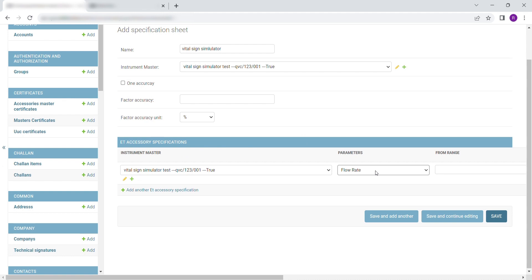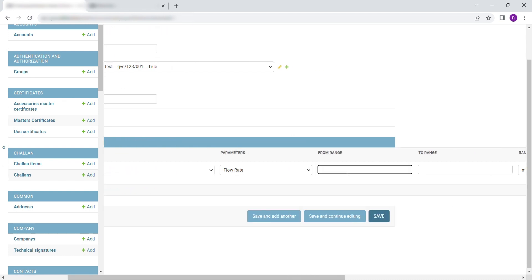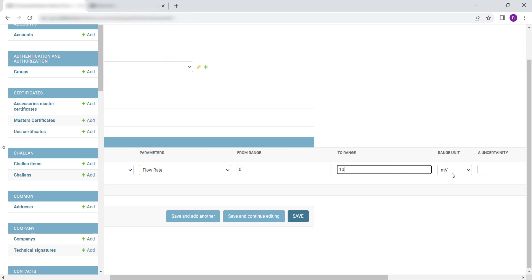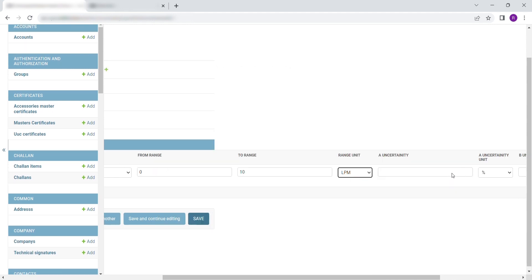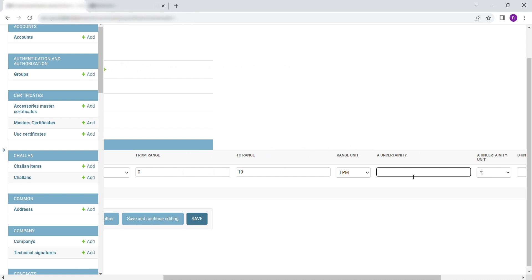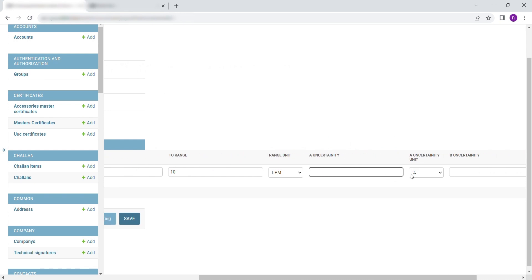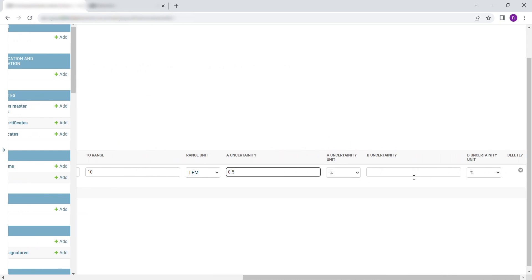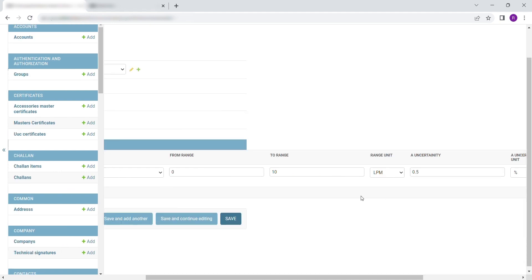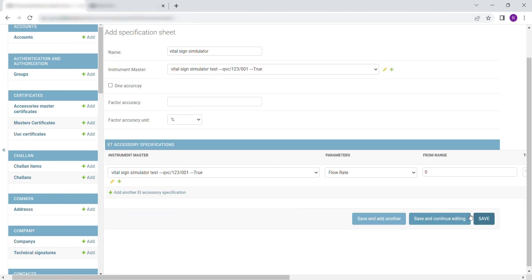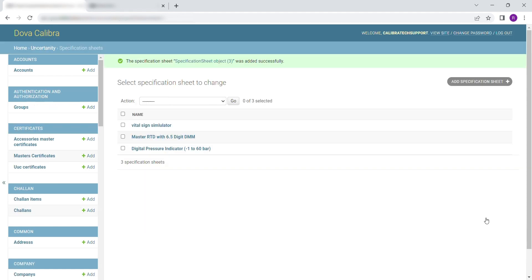Select the Parameter. Enter the Start of the Range and the End of the Range. Select Unit. After filling in the essential details, click on Save to save and exit, or Save and Add Another to continue adding specification sheets.